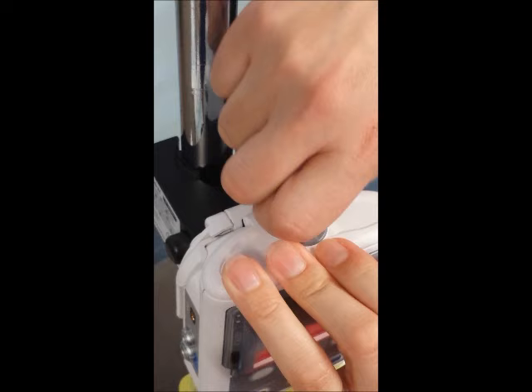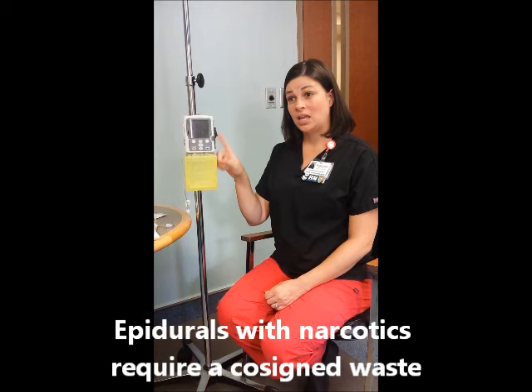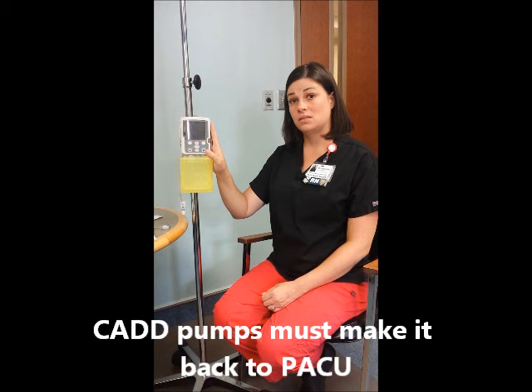When the physician has DC'd the CAD pump, it's the RN's responsibility to assist with co-signing and wasting with the anesthesiologist. Each of the pumps can be cleaned using any of the wipes. Be careful of the electronics on the bottom — you never want to submerge it in any water. All pumps need to be returned to the PACU. They can either be sent with anesthesia at time of DC, or you can call the PACU to return the pump.